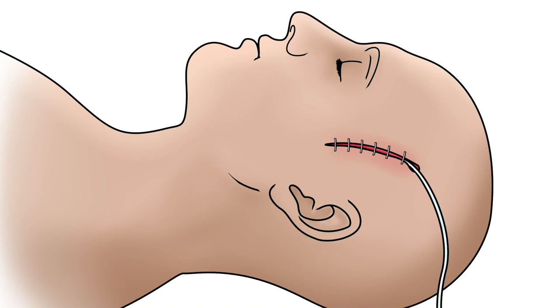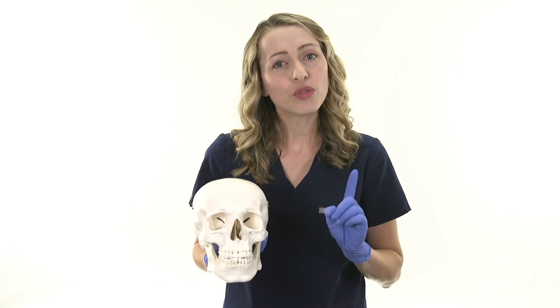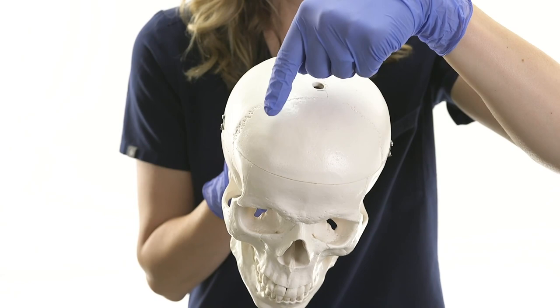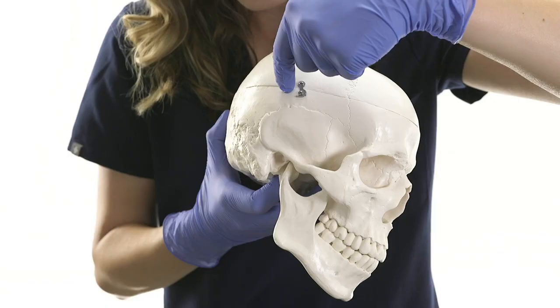Now you're pretty much done. Our neurosurgeon peer reviewer recommended that you leave a drain in place and staple the skin closed for hemostasis during transfer. If you've attempted this procedure blindly because you didn't have a CT scan and you did not find the hematoma, you're going to repeat that temporal burr hole but on the contralateral side. If you still didn't drain the hematoma, go back to the ipsilateral side for a frontal burr hole — start midline to the pupil and go back to the coronal suture, just about one centimeter anterior to it. If you still didn't drain the hematoma, you can attempt a parietal burr hole: start at the external auditory meatus and go about three centimeters superior and four centimeters posterior, so you're over the parietal eminence.